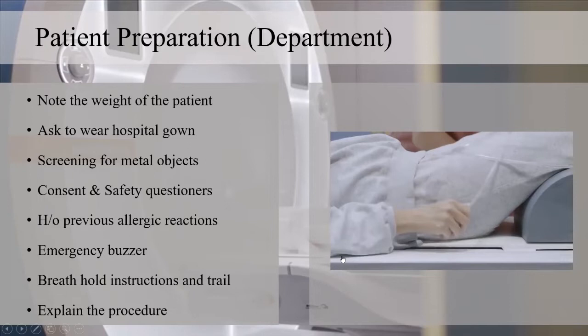Explain the complete procedure: it will take this much time, there will be sounds, and the patient should not move. So explain those things. When this is done, we can start with the scan.